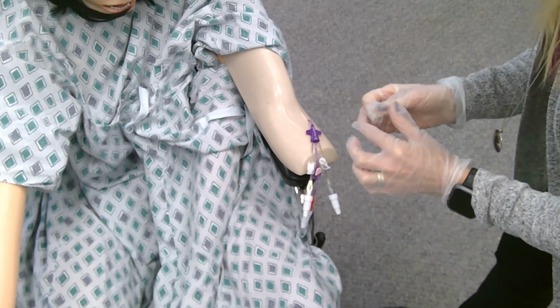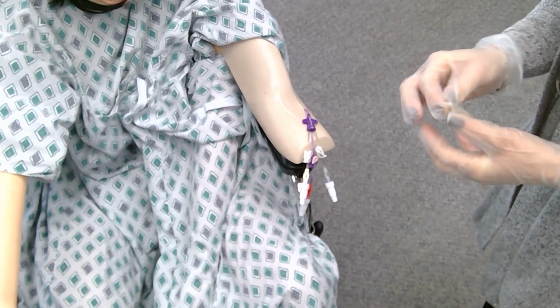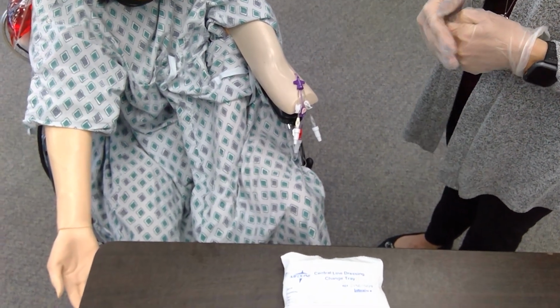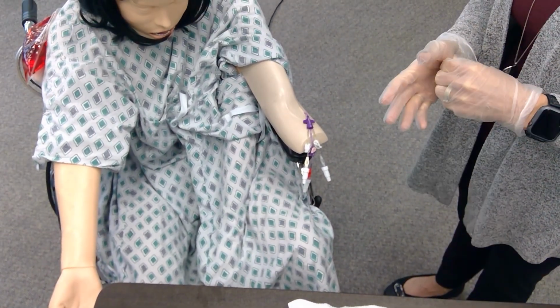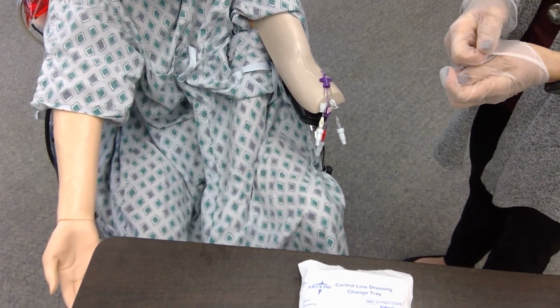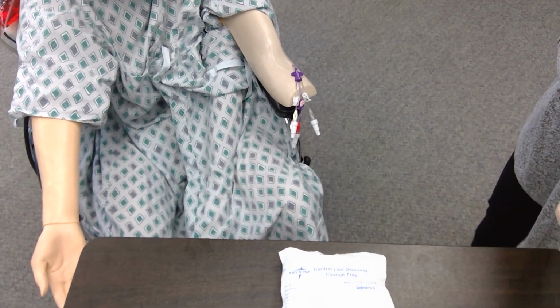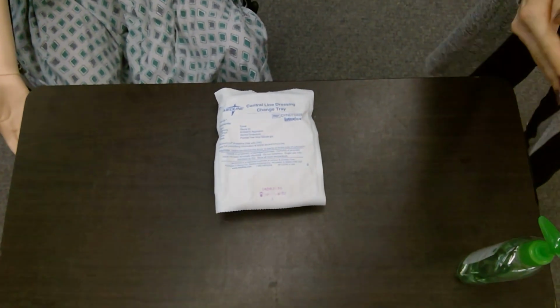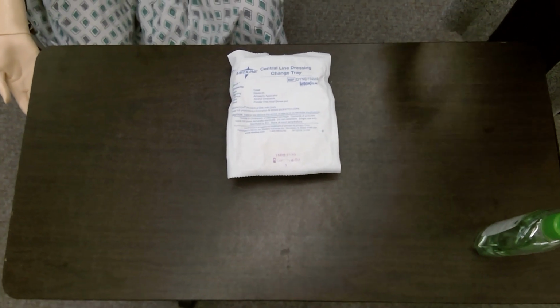All right, Sarah, I think that's the worst part, is that dressing. When I have the dressing off, I'm going to inspect the insertion site. I'm looking for any redness, any drainage that would indicate some type of infection. Then I'm going to remove my gloves and wash my hands. Now I'm going to open my sterile kit.